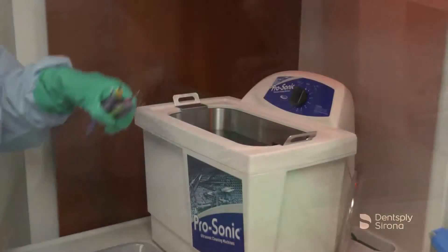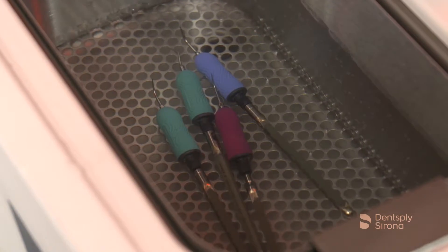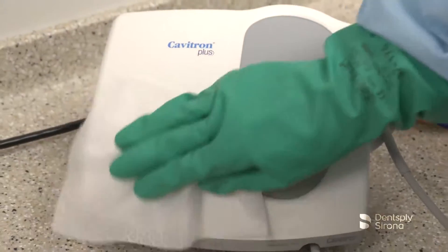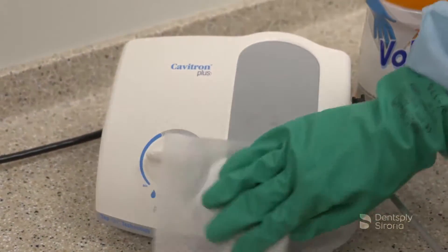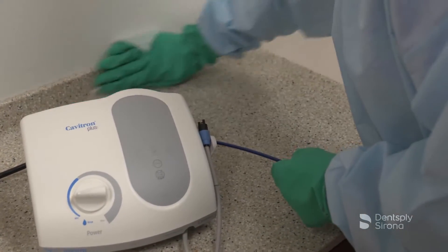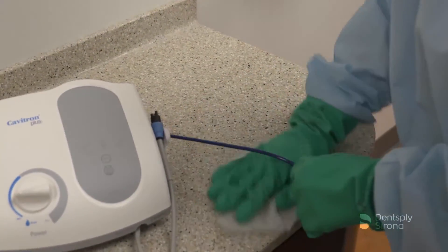Now that the soiled instruments have been transported and reprocessing steps are underway, disinfection of the Cavitron Plus unit and its surrounding surfaces must be achieved prior to the beginning of another treatment session. A two-step cleaning process is recommended when visible soil and debris are present on environmental surfaces. The soil and debris must be cleaned prior to disinfecting the surface with a disinfectant wipe or spray.